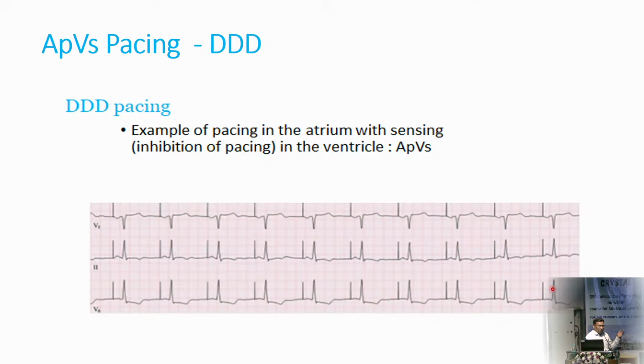goes wrong in future, if the patient develops AV node disease, and of course ventricular pacing is more important for the patient. For an AAIR pacemaker, the criterion is that we need to check Wenckebach, which means the Wenckebach phenomenon, which means we are going to check the capability of the AV nodal conduction, right? If the capability of AV nodal conduction is good, then an AAIR pacemaker can be given. Otherwise, a dual chamber pacemaker.